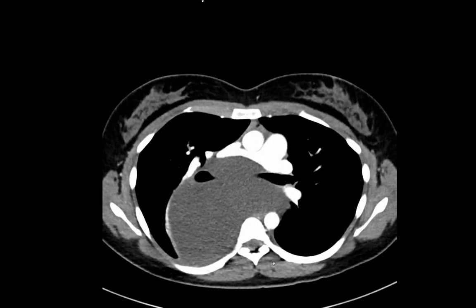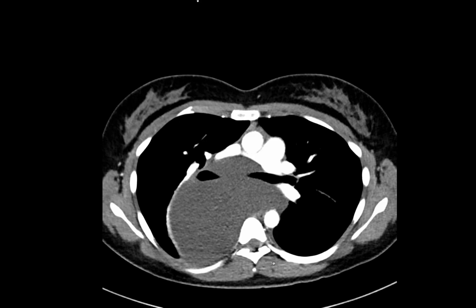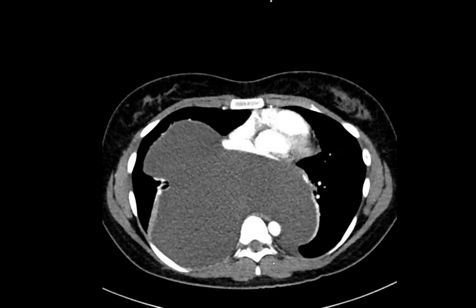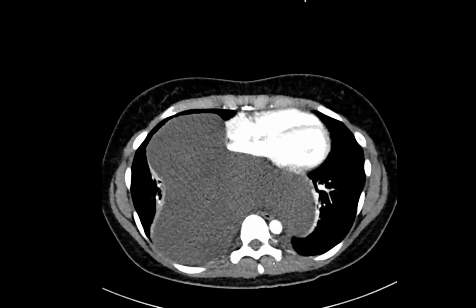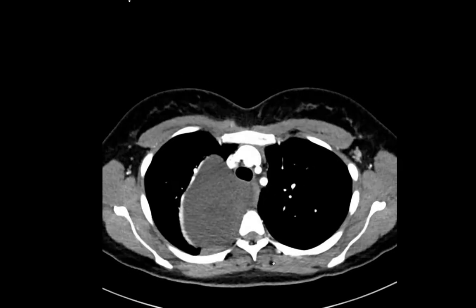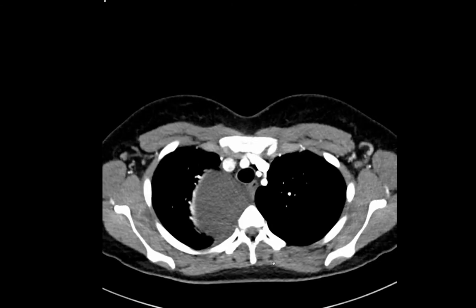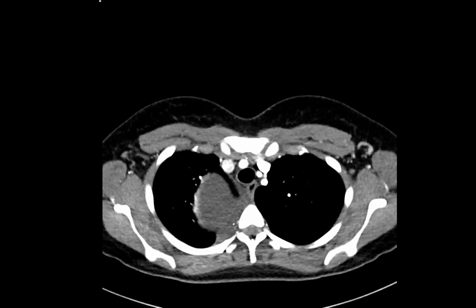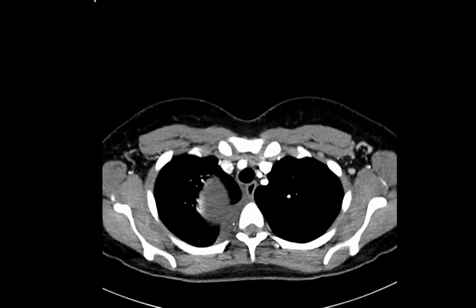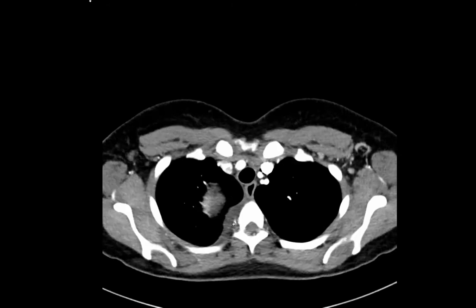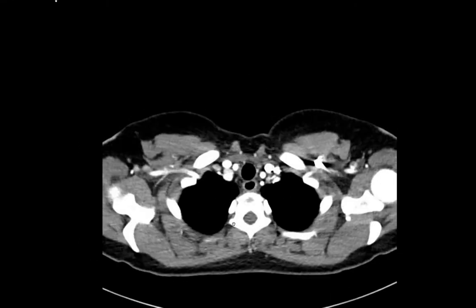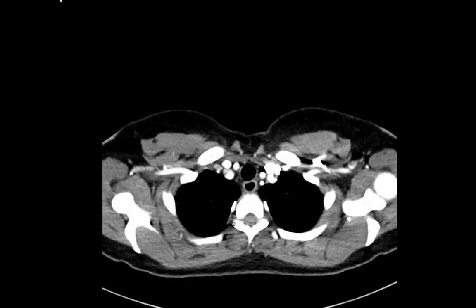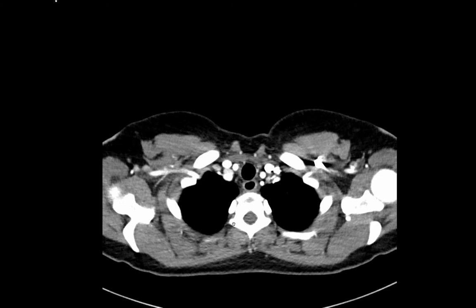Lymphangioma is another good thought. Whatever it is, it's probably very slowly growing given how big it is. Scrolling to the top of it, it has a very broad interface with the paravertebral region, suggesting it may be growing from the chest wall. It's centered right paraspinal and expanded in every direction — I agree with nerve sheath as a possibility. Lymphangioma also fits because it looks like it's going through multiple mediastinal spaces, and MRI can be striking in lymphangiomas with internal structure invisible on CT. We're lobbying for an MRI, and we'll have an answer soon.